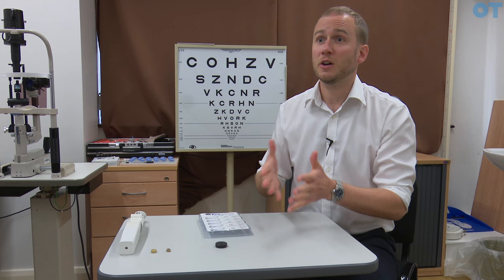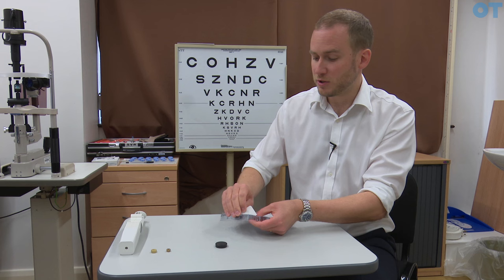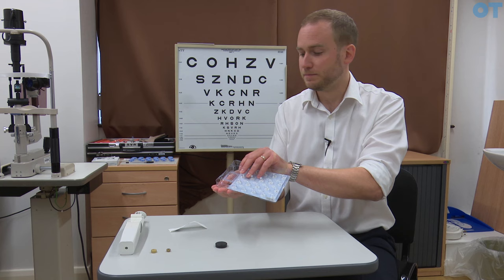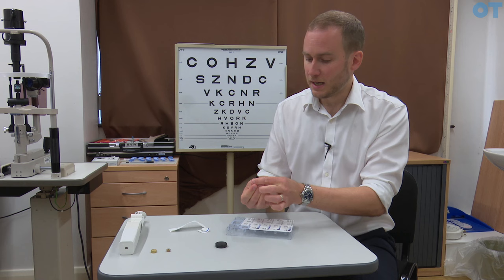We can use the original probe of a Goldman or a Perkins tonometer, but with the risk of cross-infection with things such as CJD we now use disposable probes. This is an example of a disposable probe — this is the Tono-Safe. If we open the Tono-Safe there are two main elements: the black housing, which is what we keep, and the disposable tip. There's a little notch on the black housing which is what we use to align with the disposable tip.